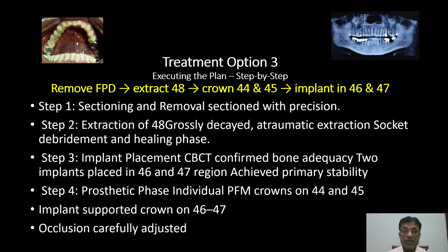And the occlusion which I discussed previously, that the natural tooth is loaded more compared to the restoration supported by implant due to the difference in movement, by using different thickness of articulating paper, namely 8 to 12 micrometer or 14 micrometer.